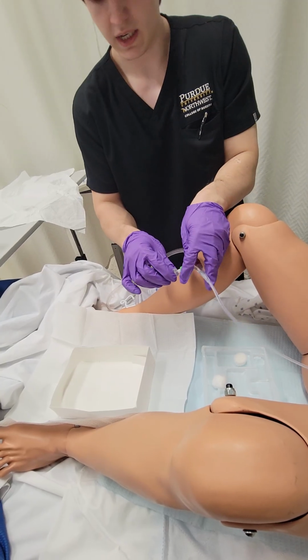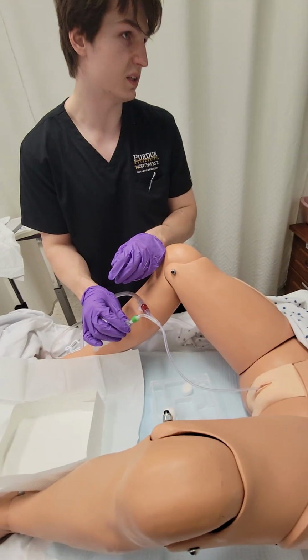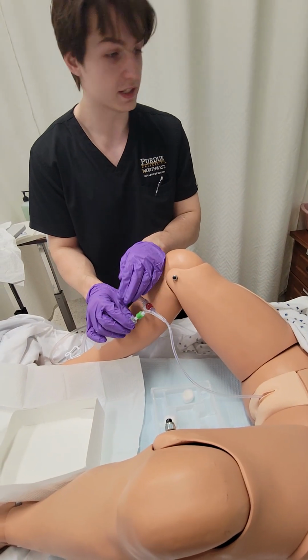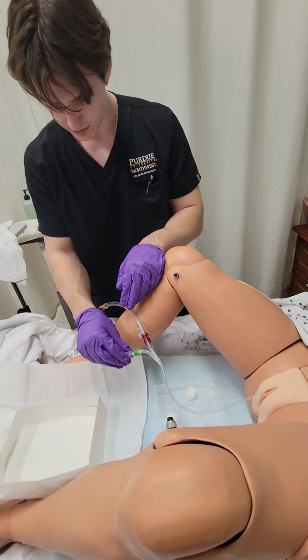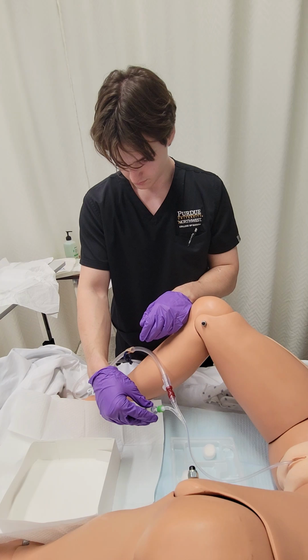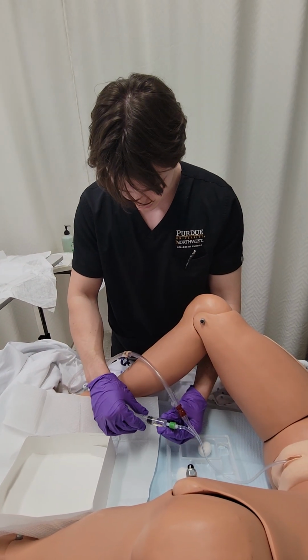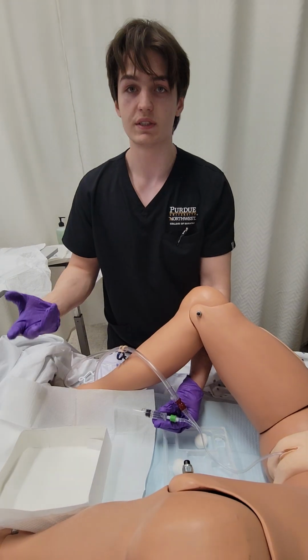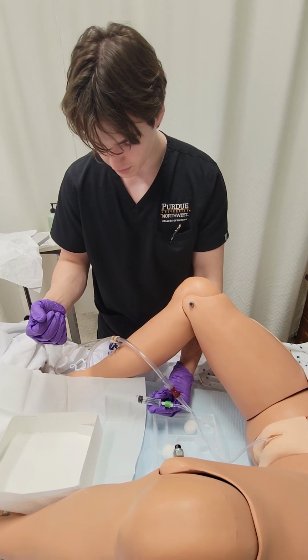Alright, so Miss Johnson, we're about done with this procedure. Would you like to do your own pericare, or would you like me to do that again for you? You'd like to do it by yourself? It's great. We love it when our patients take their own health care and well-being into their own hands. It looks like the flow is still going. So if the flow were to stop, I would notify the physician, but it's still going.